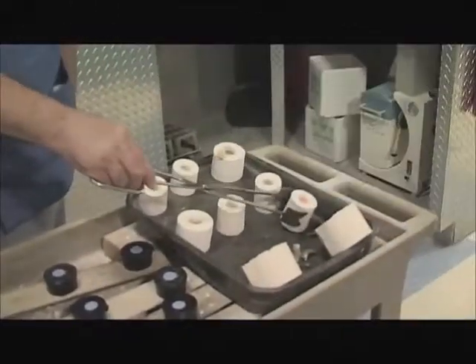Proper personal protective equipment should be worn. When breaking up the investment, the hammer should contact the investment at the metal button to prevent damage to the thin margins of the restorations hidden inside the investment.